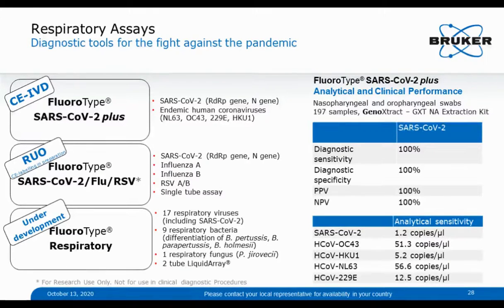This is one of the assays that we are developing, which are called so-called syndromic panels. That means detection not only from one class like virus or bacteria or parasites or fungi, but just according to the syndrome, wherever it comes from, detect the pathogen. Further developments in this area are, as an example, detection of pathogens that are causing gastrointestinal infections.